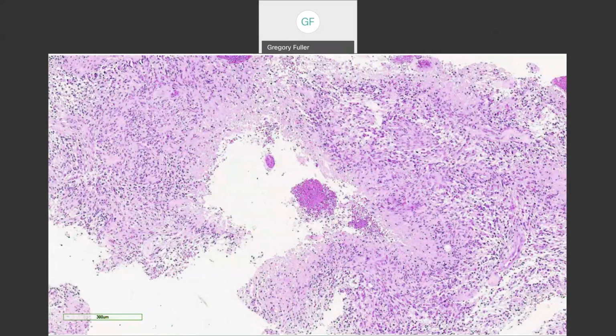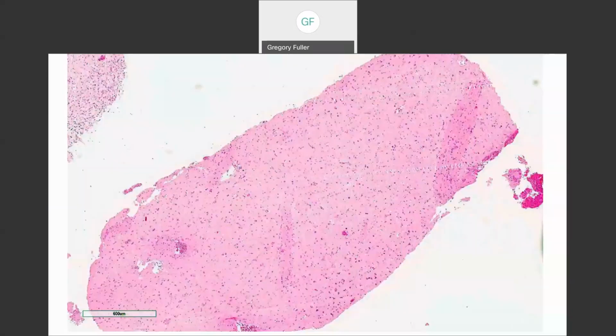Question: why am I showing you this case? You had a left frontal lobe glioblastoma. What is unusual about that? Why would it warrant being shown in the IDMCC? It wouldn't. So there's a problem, and here was the problem. Amidst the fragments of glioblastoma, there were 4 fragments that looked like this. This is the first fragment I saw, and I thought, wait, there's a disconnect. Something is wrong. What is wrong?